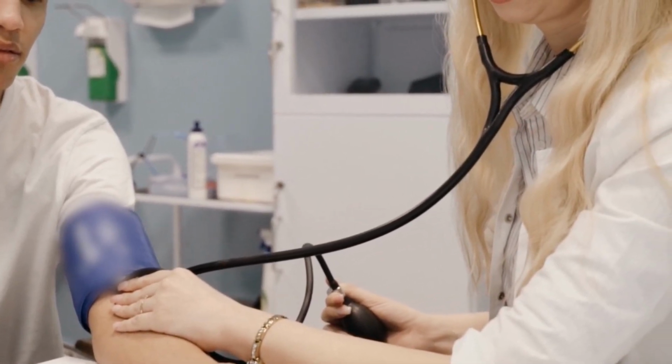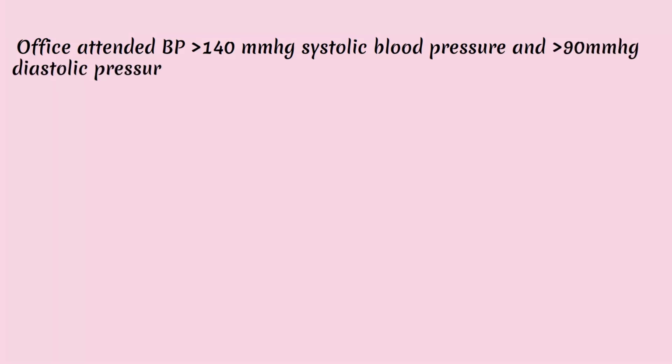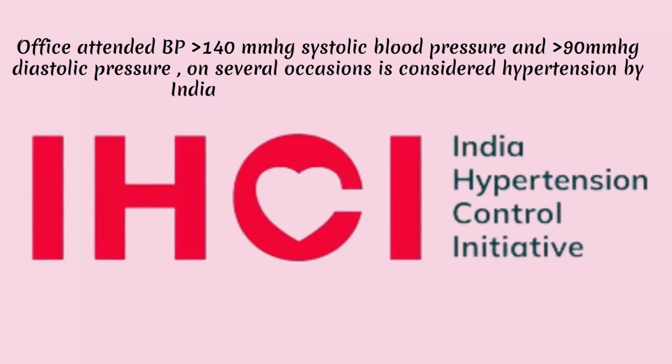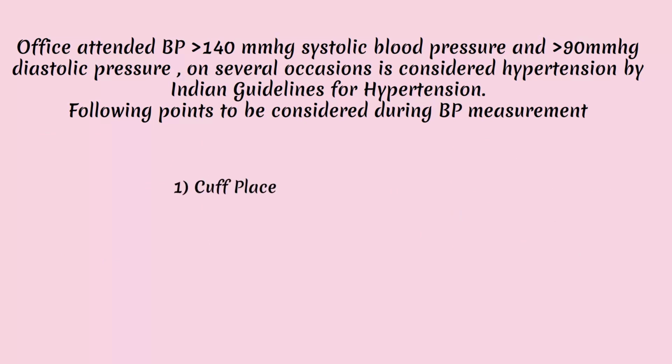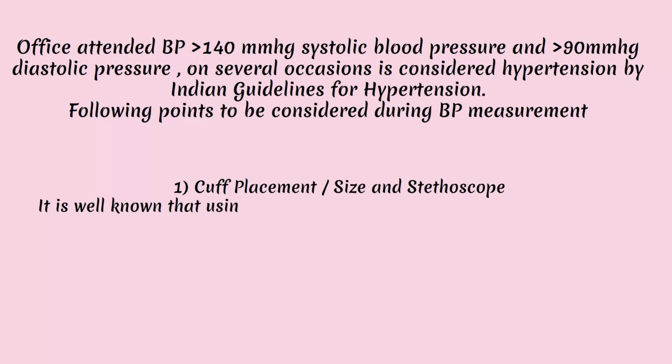Office-attended BP of more than 140 mmHg systolic and more than 90 mmHg diastolic on several occasions is considered hypertension by Indian guidelines for hypertension. Following points to be considered during BP measurement. Cuff placement and its size. It is well known that using an improper cuff size can lead to an inaccurate BP measurement.